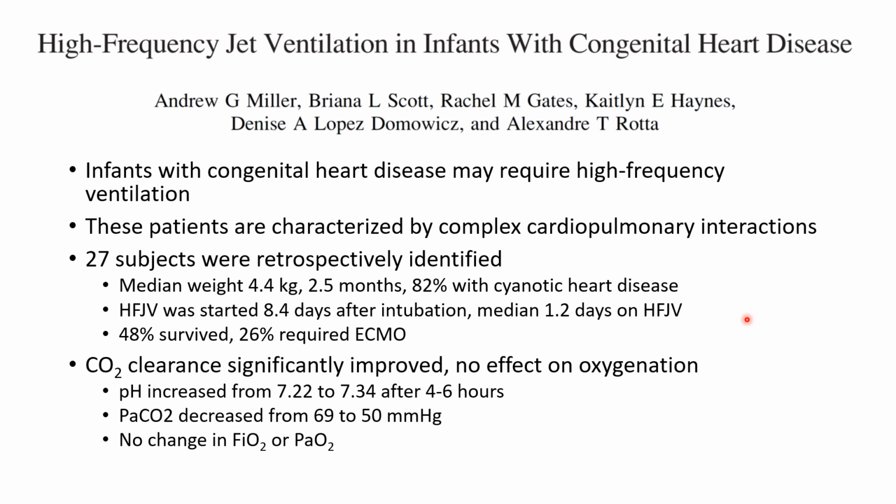was started much later in contrast to our study in the PICU, so 8.4 days in this study versus 0.6 days in the PICU. The patients didn't spend as long on high-frequency jet ventilation, only 1.2 days, which may be a characteristic of the patient population, where they improved rapidly. Then 48% survived and 26% required ECMO. Similar to our other study, we found that CO2 clearance significantly improved, but there was no measurable effect on oxygenation.